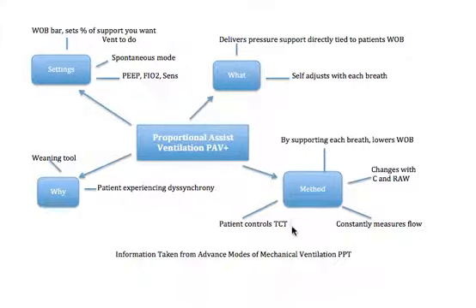So the patient controls the total cycle time in this mode. The patient controls when the breath starts and when the breath ends because it's a spontaneous mode.